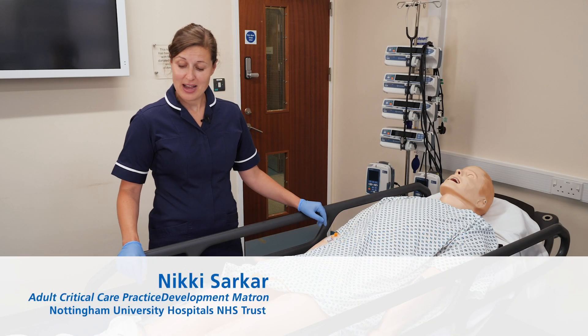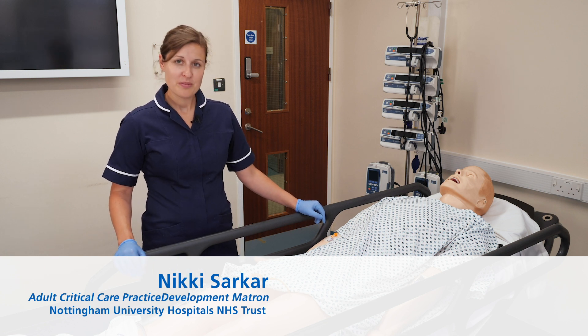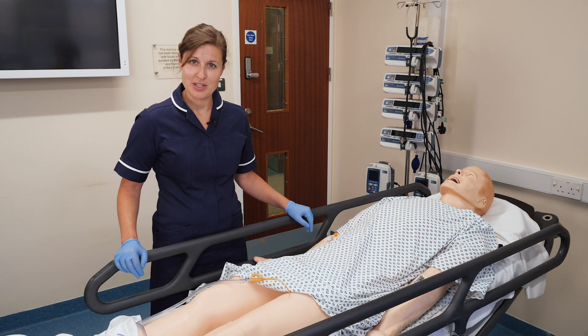Hi, I'm Nikki and I'm here to talk to you about securing urethral catheters to patients. Before we start, we make sure the patient's comfortable, we've explained the procedure to the patient beforehand, and we maintain patient privacy and dignity at all times.